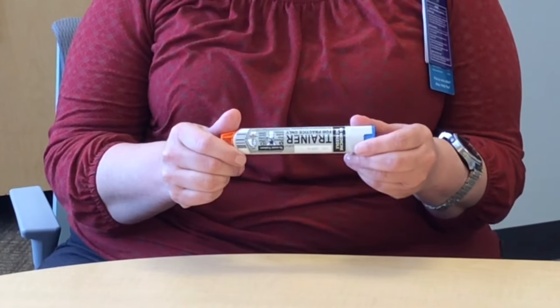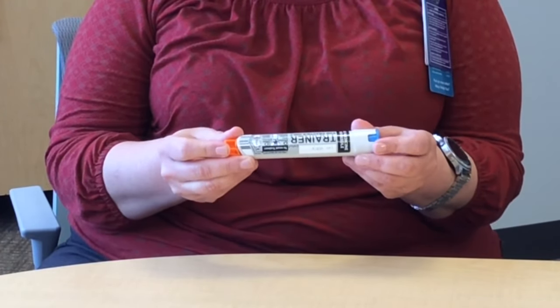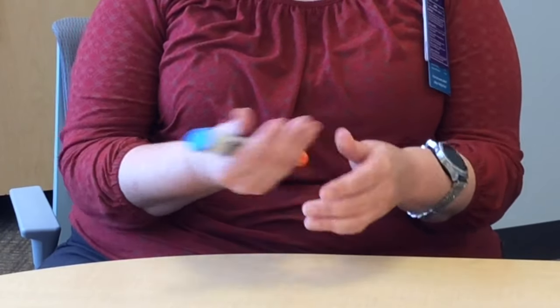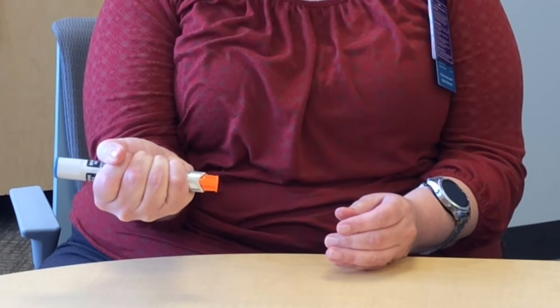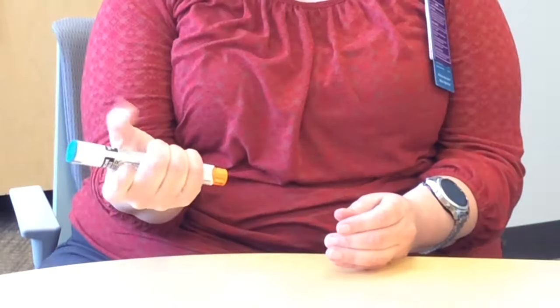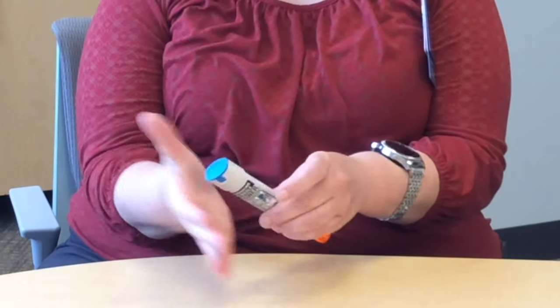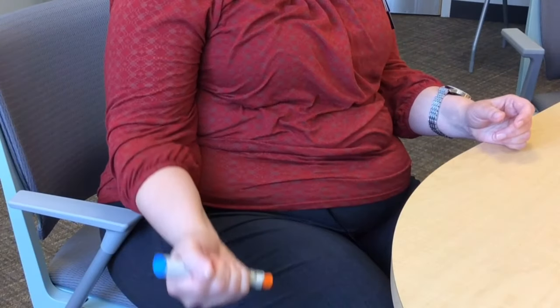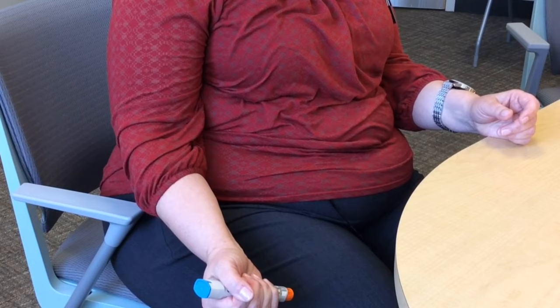You will want to remove your auto-injector from its tube-like case. Place the auto-injector in the palm of your hand and wrap your hand around it like a fist. Do not put your fingers, thumb, or hand on either end of the auto-injector. Place the orange end near the middle of the outer part of your thigh.